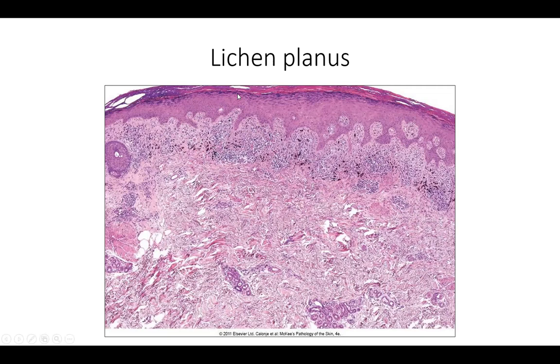The overlying epidermis contains hypergranulosis that gets thinner and thicker in areas — the so-called wedge-shaped hypergranulosis — with overlying hyperorthokeratosis. You can have some focal parakeratosis, and eosinophils in lichenoid inflammation would make you think more about a lichenoid drug eruption. Classic typical lichen planus usually lacks significant eosinophils and significant parakeratosis.